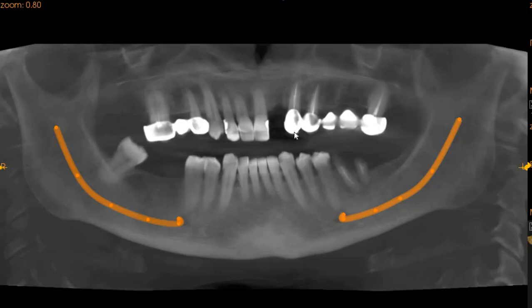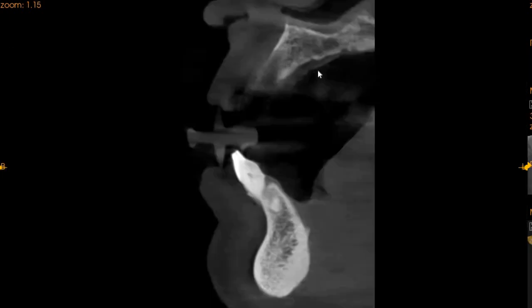Moving to the panoramic view, we can see that we have adequate distance between the central incisor and the canine, which is part of the bridge. On the transaxial view, we can see that there is a lack of a buccal cortical plate in this region.